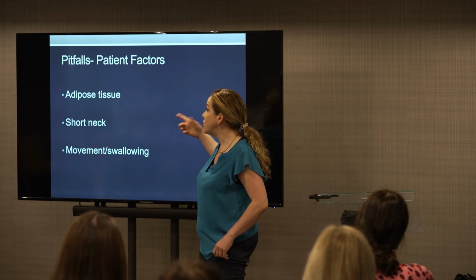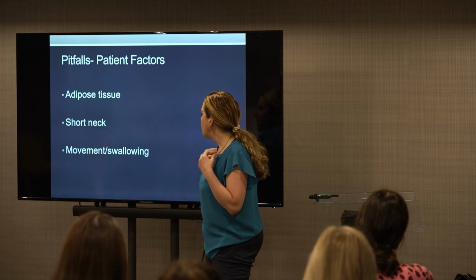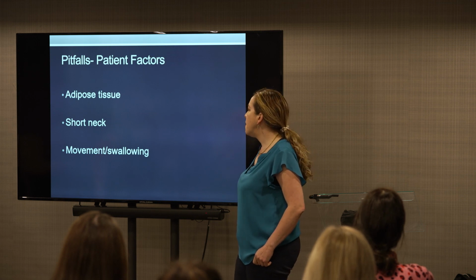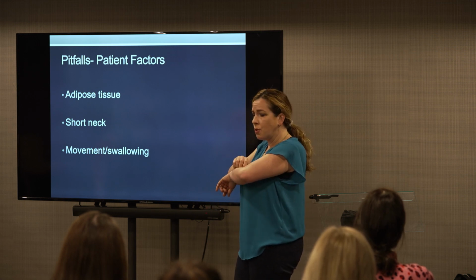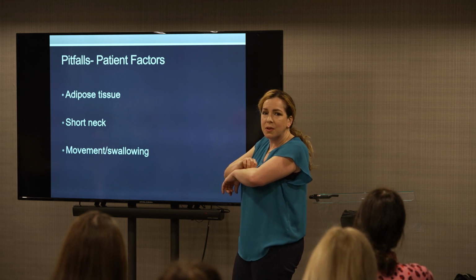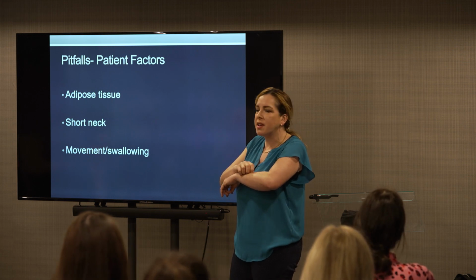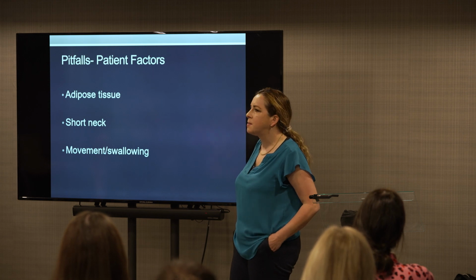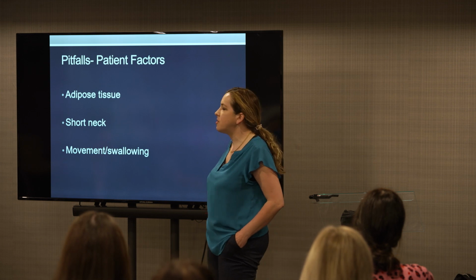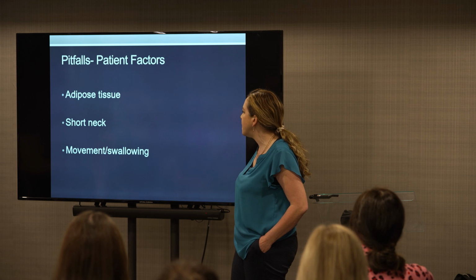Short neck, some people just have a short neck with no gap between the chin and the clavicles. Movement and swallowing, people who are very short of breath, it is tricky. I tend to not mention swallowing at the start of the procedure because once you start saying don't swallow, they start swallowing non-stop and looking really anxious. So I wouldn't say the S word, just get on with it. Say lie down, chat to them, distract them and just get on with it. Don't make a big deal about swallowing.